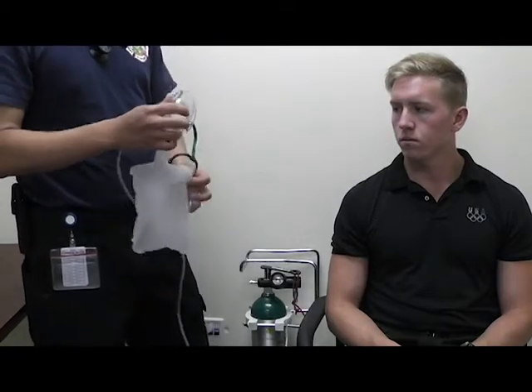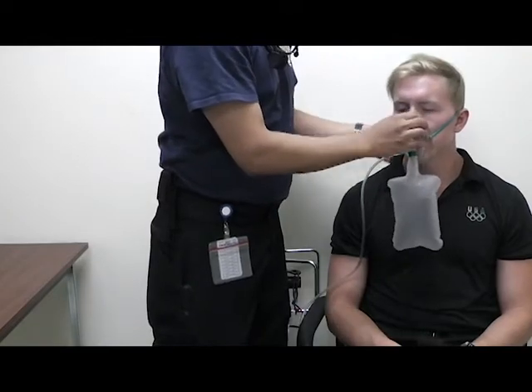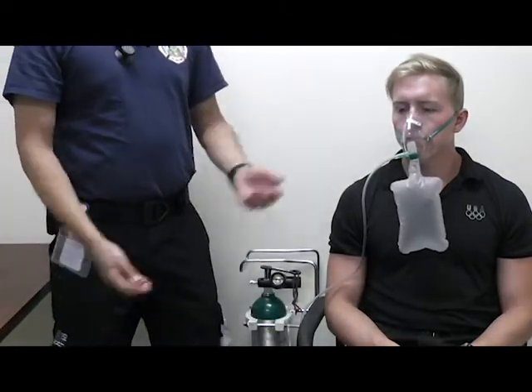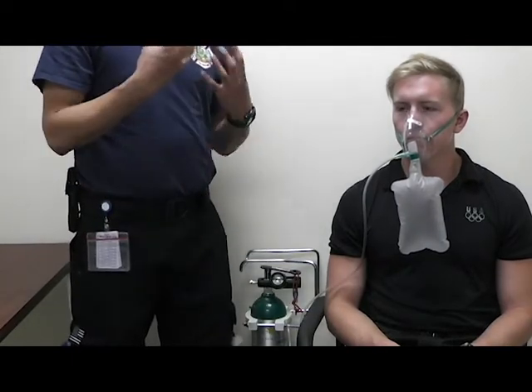You're then going to take the mask, form it, and place it over the patient's head and on their face. This allows the patient to breathe in and out while releasing the CO2 and only taking in oxygen.